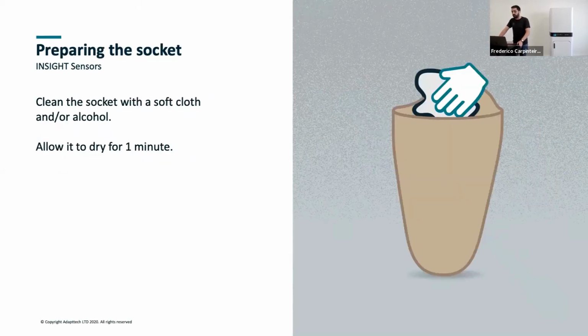The same with the socket. So you should always prepare the socket by cleaning it with a soft cloth and alcohol and let it dry for a while before applying the sensors. Just make sure that you have a good adhesion and that everything is well. Next slide.